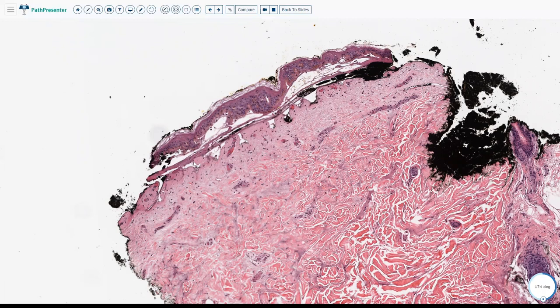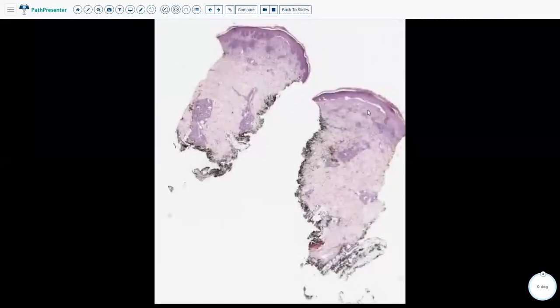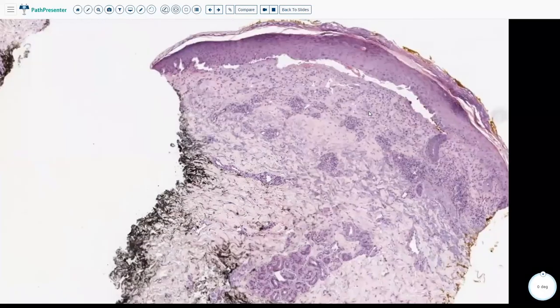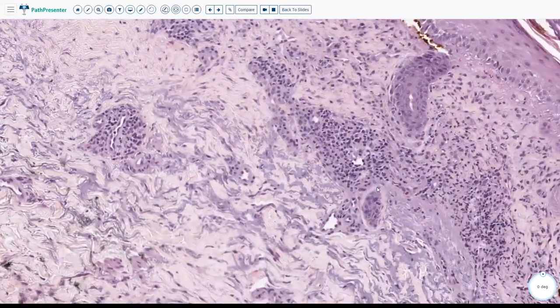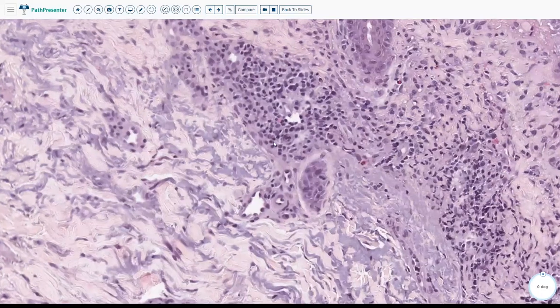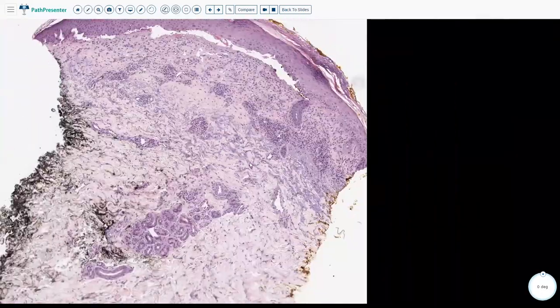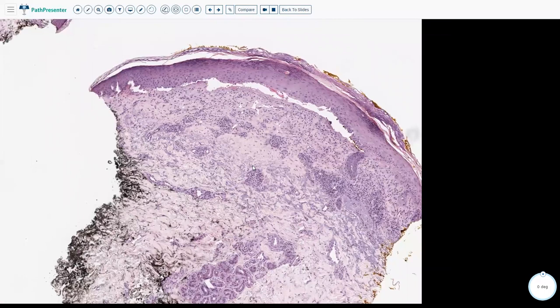If this is cell-poor bullous pemphigoid, you would also see a linear IgG and C3 at the dermal-epidermal junction on immunofluorescence. In cell-poor BP, there is some inflammation predominantly composed of lymphocytes with some eosinophils. The immunofluorescence pattern and the age of the patient help make the diagnosis — even in a cell-poor sub-epidermal split, bullous pemphigoid should always remain in your differential.